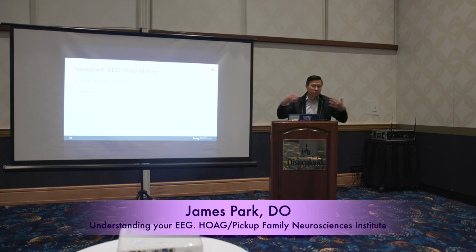We could do a 72-hour EEG, but if we just happen, by chance, not to catch what we wanted at that time, and it's normal, it doesn't necessarily rule out epilepsy. I've seen patients who have normal-looking EEGs up until the moment they have a seizure. So again, a normal EEG doesn't 100% rule anything out.